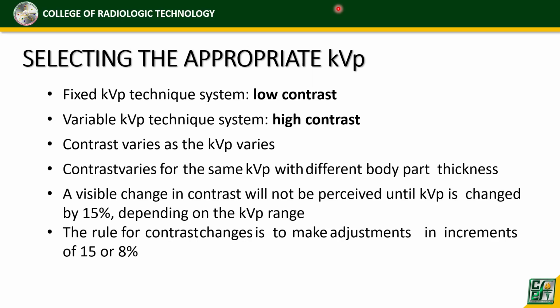Selecting the appropriate KVP. Okay, so fixed KVP technique system, low contrast. Variable KVP technique system, high contrast. Okay? Questions?